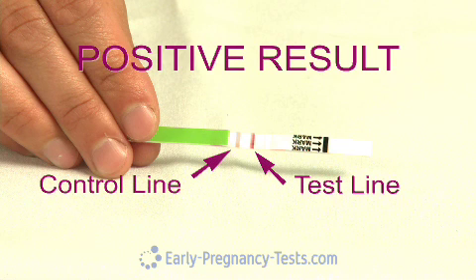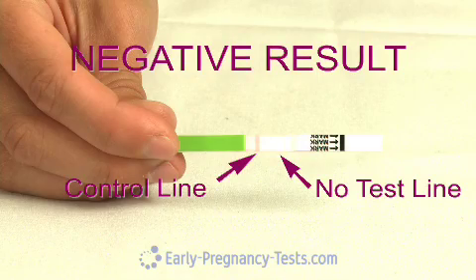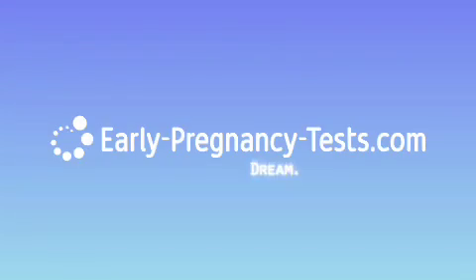Here's an example of a positive result — note that the test line is darker than the control line. Here's an example of a negative result — note that only the control line is visible and no test line can be seen. To purchase these ovulation tests and for all your other preconception product needs, visit us today at EarlyPregnancyTest.com.